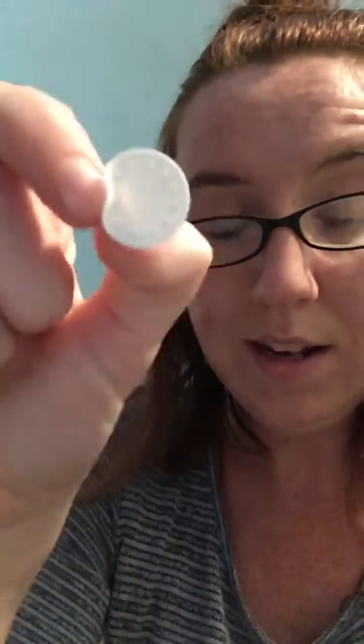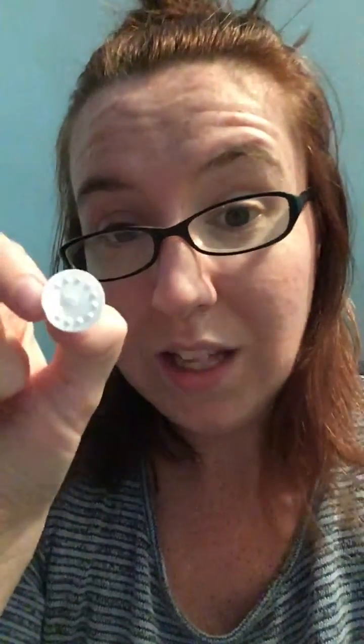You need to make sure, especially if you're using your pump frequently, if you're at work, that you are changing these white membranes pretty darn frequently. If you're pumping for a full 40 hours Monday through Friday at work, I would replace these weekly, honestly. They really do make a huge difference when it comes to pumping. And if you ever notice that your output is decreasing for some reason, I would jump first to changing these little white rubbery pieces of equipment, because it really does make a difference.